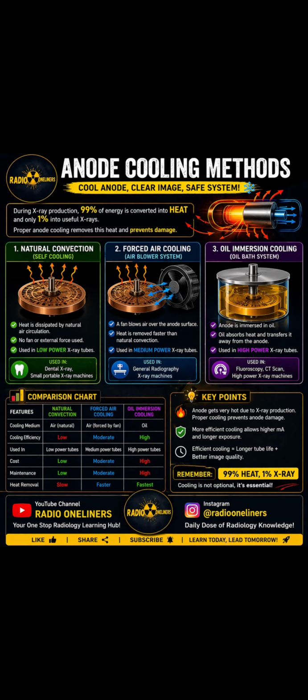How does it work? Here heat is removed by natural air circulation. We circulate the natural air inside the tube and the heat is removed with the help of a method known as convection. No fan or external system is needed. Mark this, that no fan and no external system is used. Now the question is, where do we use this method? We can use this method in low power X-ray machines like dental machines. Simple system, but cooling is very slow, so we can't use this in very high power machines like CT, etc.